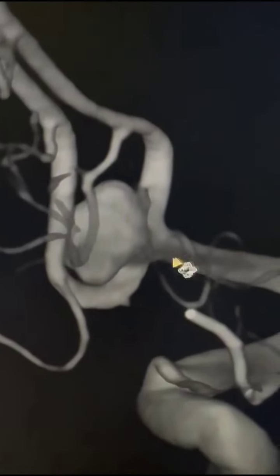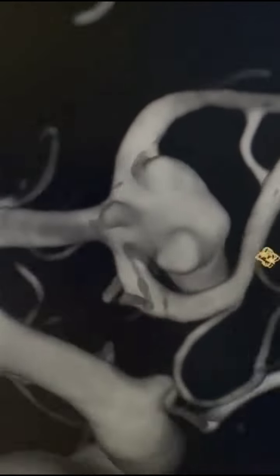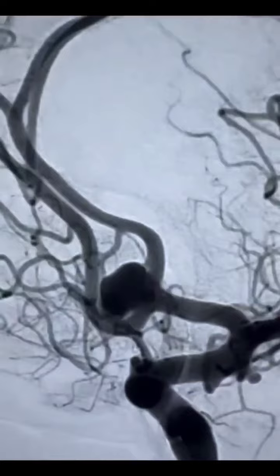We discussed the management of this broad-based multi-lobulated ACOM aneurysm. We note that there is a superiorly and posteriorly pointing lobule and a nubbing close to the base of the aneurysm in the artery. This is the AP projection and the working projection of the aneurysm in both the AP and the lateral planes.